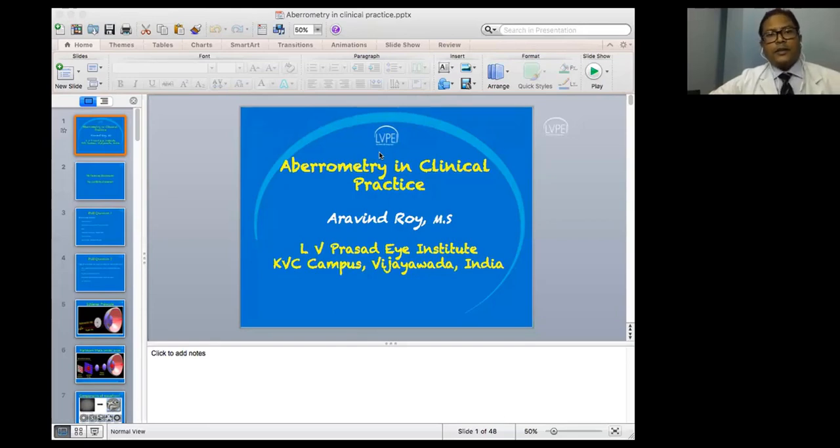This is a question about the difference between wavefront guided versus wavefront optimized. So wavefront optimized actually creates a blend zone, so that there are zones between the treated and untreated cornea, simply said. And the wavefront guided laser is basically where you take into account the aberrations of the eye and try to decrease the higher order aberrations. So you try to either bring down the total amount of aberrations that are induced by refractive surgery or decrease the amount of aberration that will be there post refractive surgery. Does that answer your question?